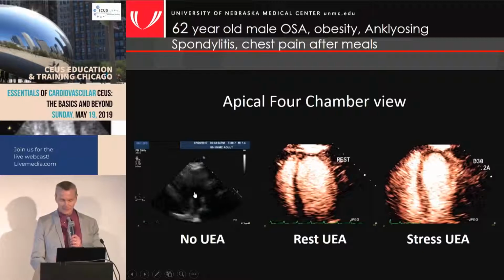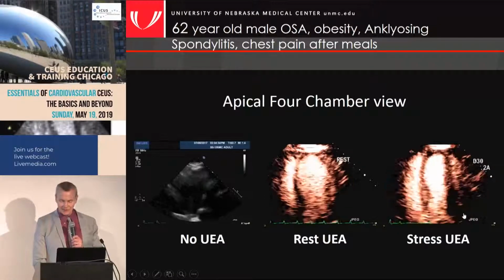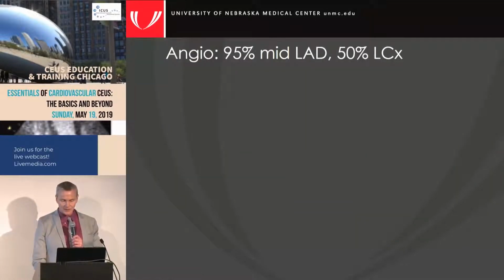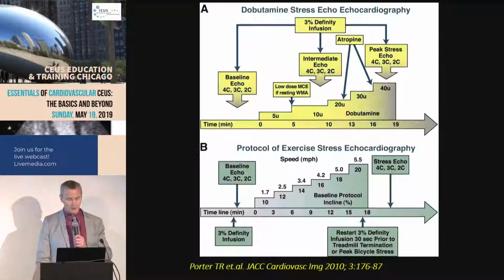Before the age of this kind of image, even if we had harmonic imaging, we would still be saying, well, we'd get a little bit in the near field, but we would not get these basal segments, which we want to look at too. We need to look at all the segments, right? And that's where this fundamental nonlinear imaging comes in. This is his angiogram findings. I don't have the actual films, but you can see this was helpful in getting this guy appropriately managed.